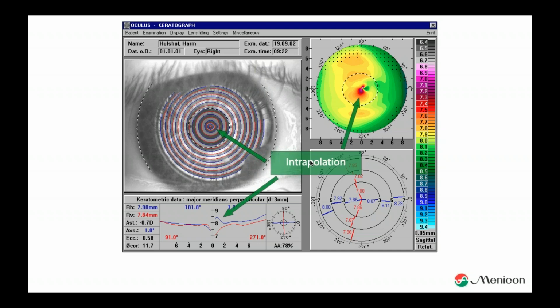We can extrapolate, but the topographer is interpolating. It's calculating back. And again, if you have light bulbs on and there are too many light rays, it gets confused and assumes maybe the wrong things. And if you assume something, well, mistakes will happen. So again, in the center area, a topographer is actually measuring nothing.